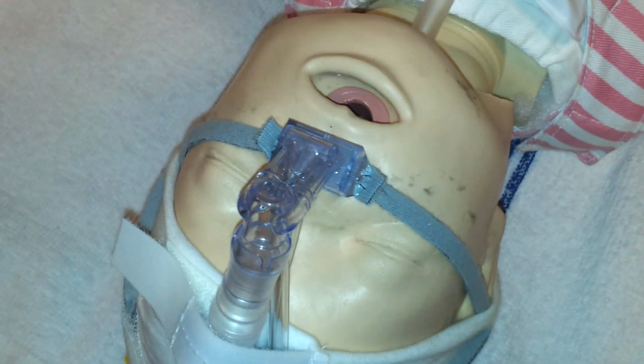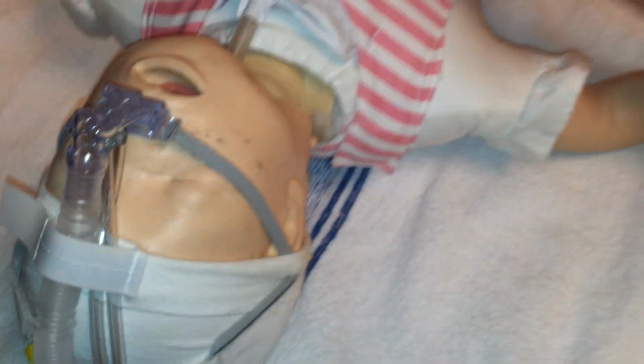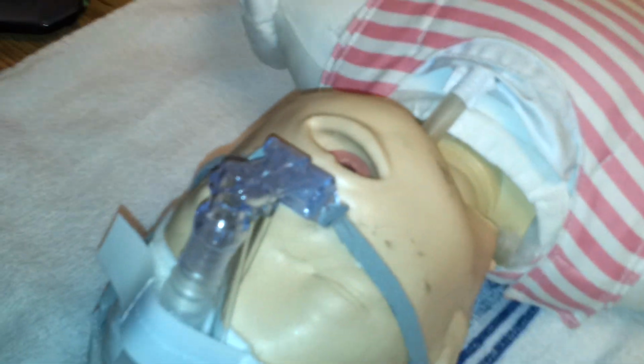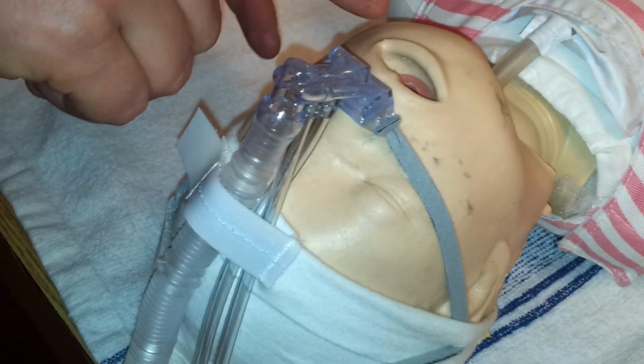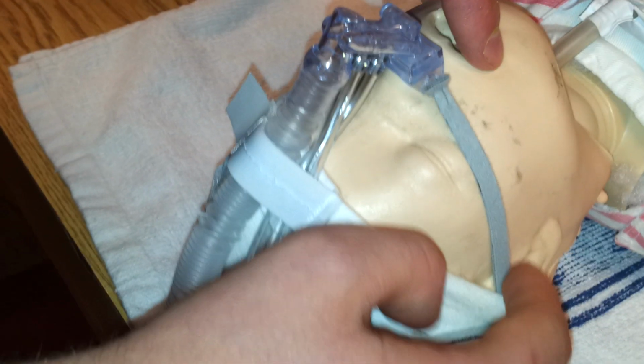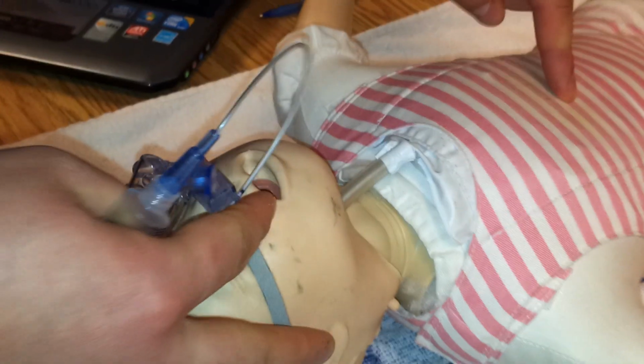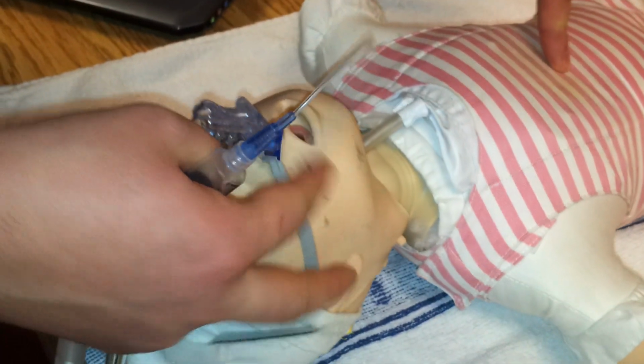So you measure the length of the OG. Depends which center you're at. I've seen oro or nasogastric from the corner of the mouth to the tragus, so from the ear to the xiphoid. And that's the distance you're going to go down.